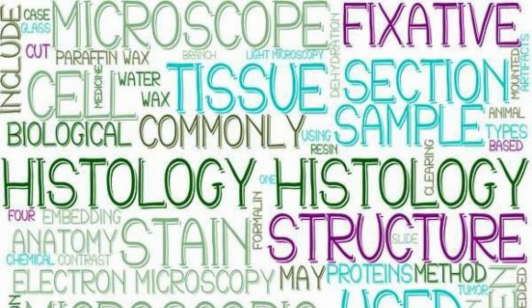Patterns aren't just microscopic art. They are the key to unlock the diagnosis. From papillary to cribriform, each pattern tells you a unique story. Mastering these helps to decode the disease. Keep exploring, keep learning, keep looking deeper. Every slide will tell you a different story.